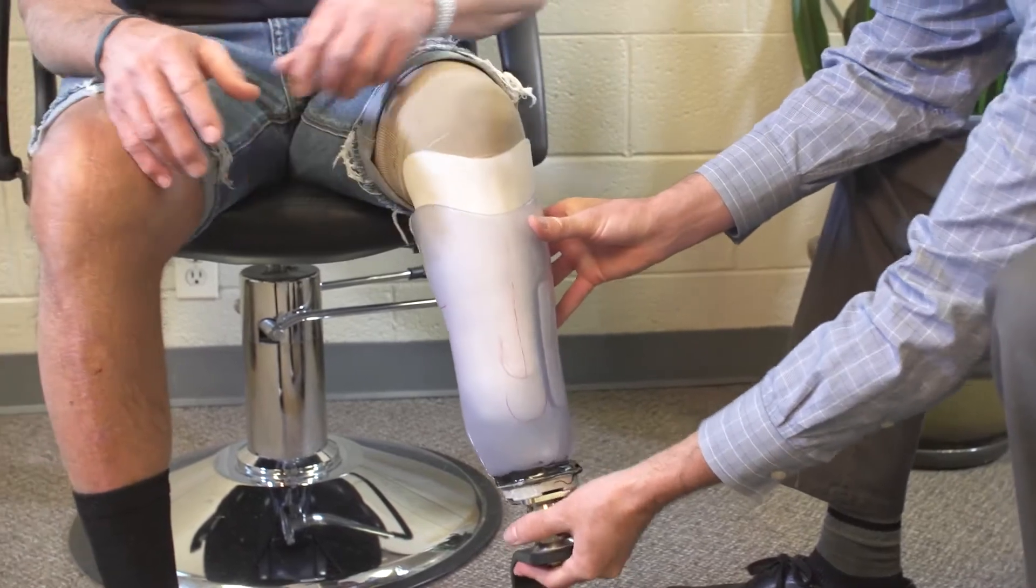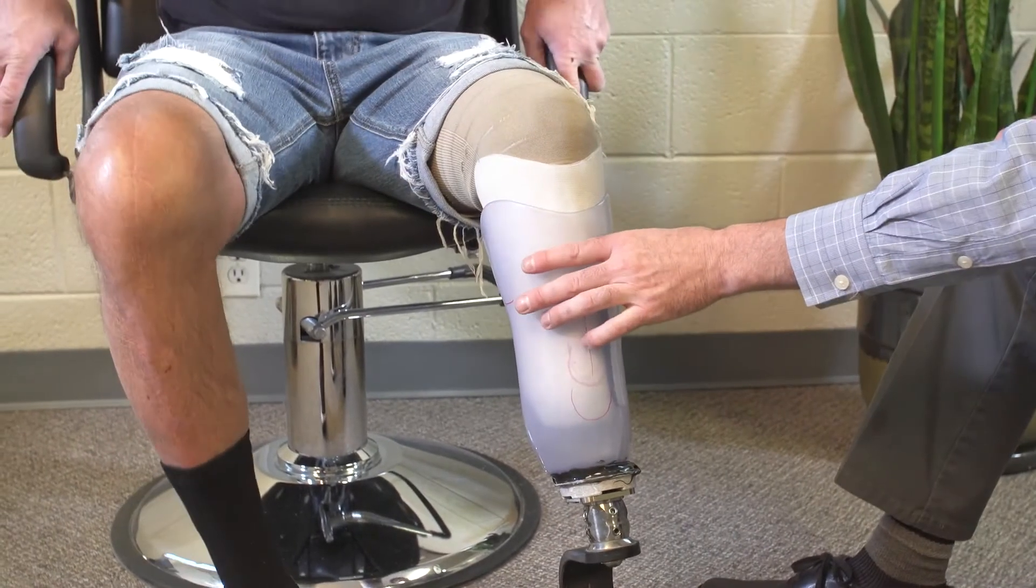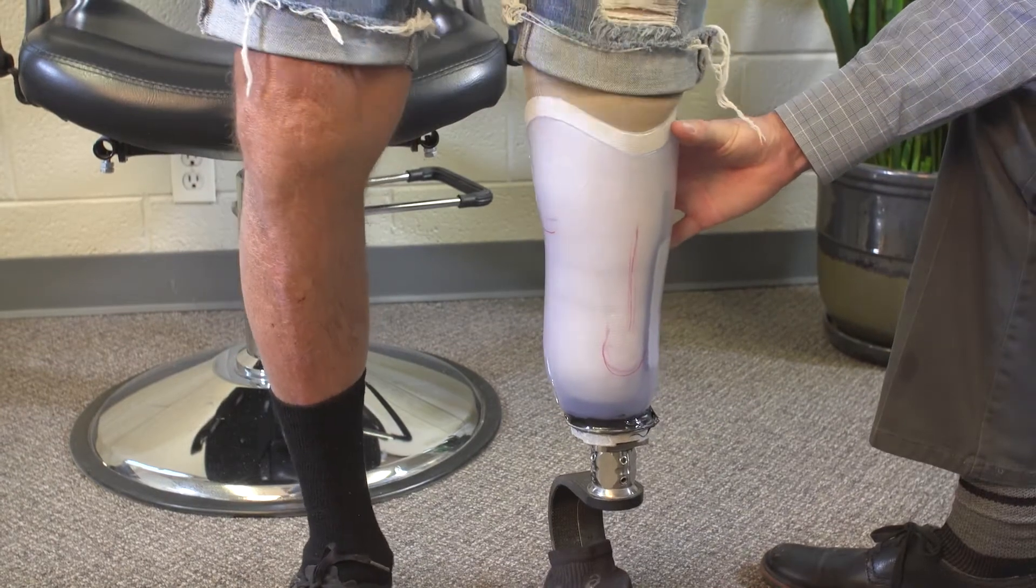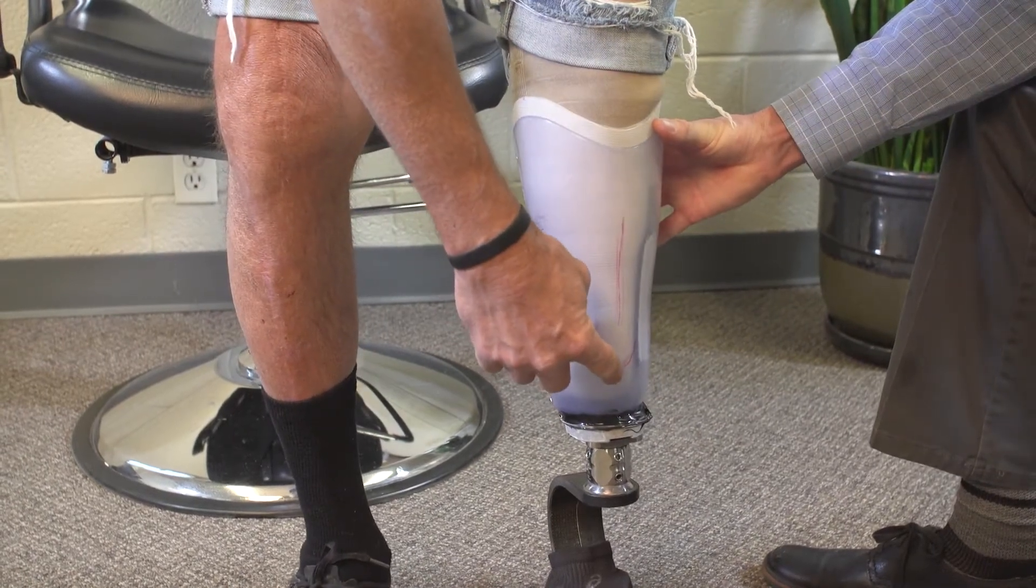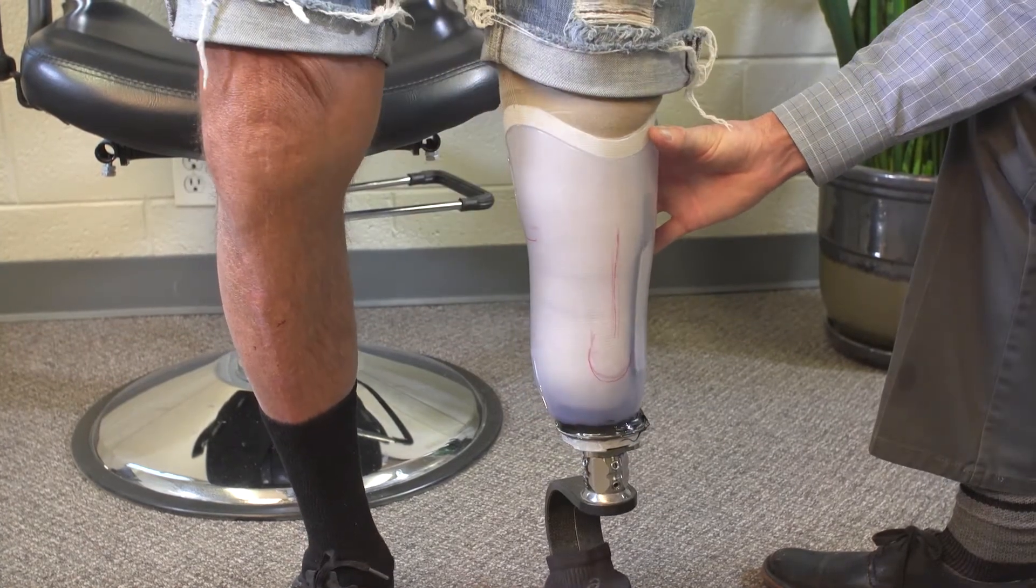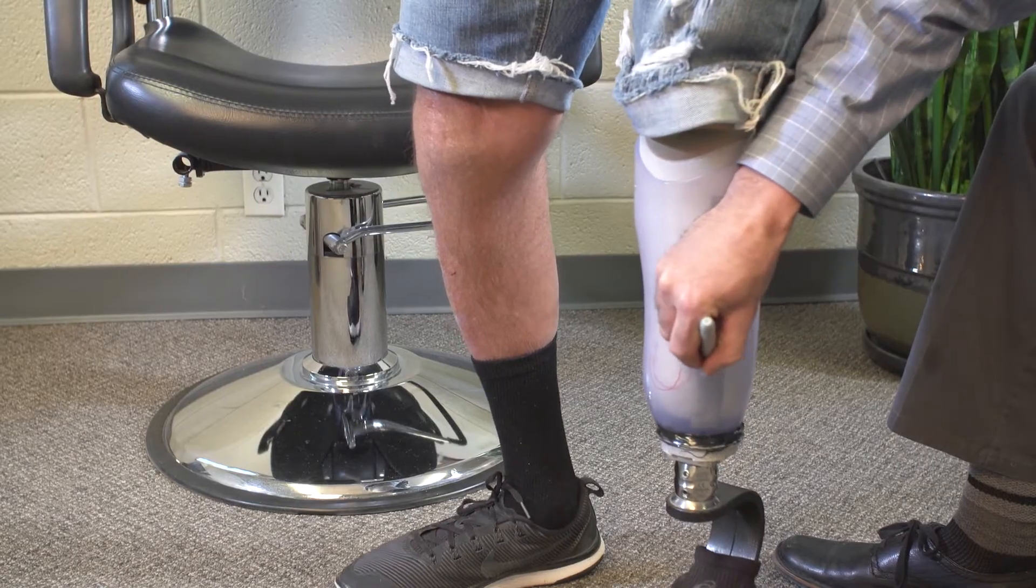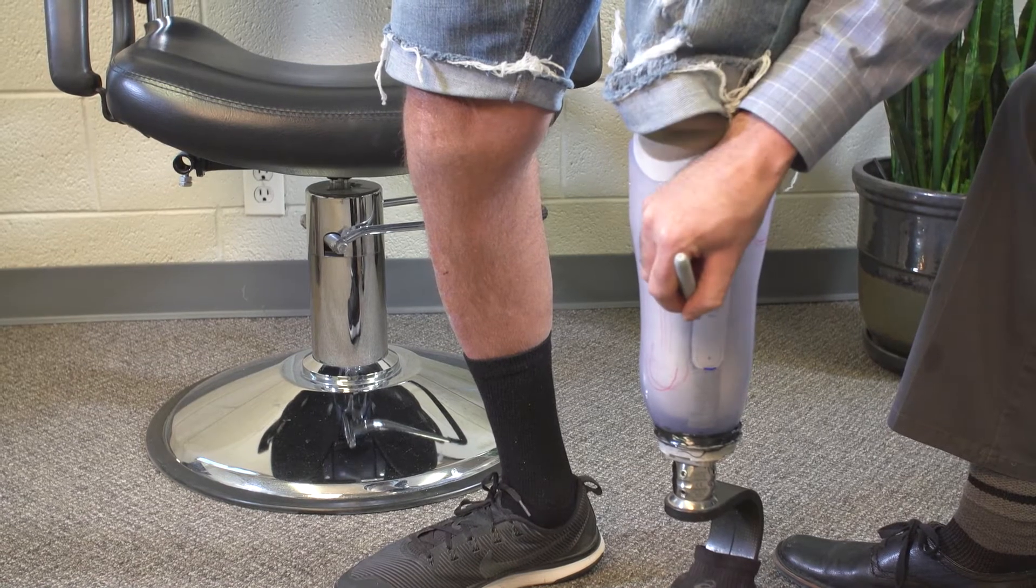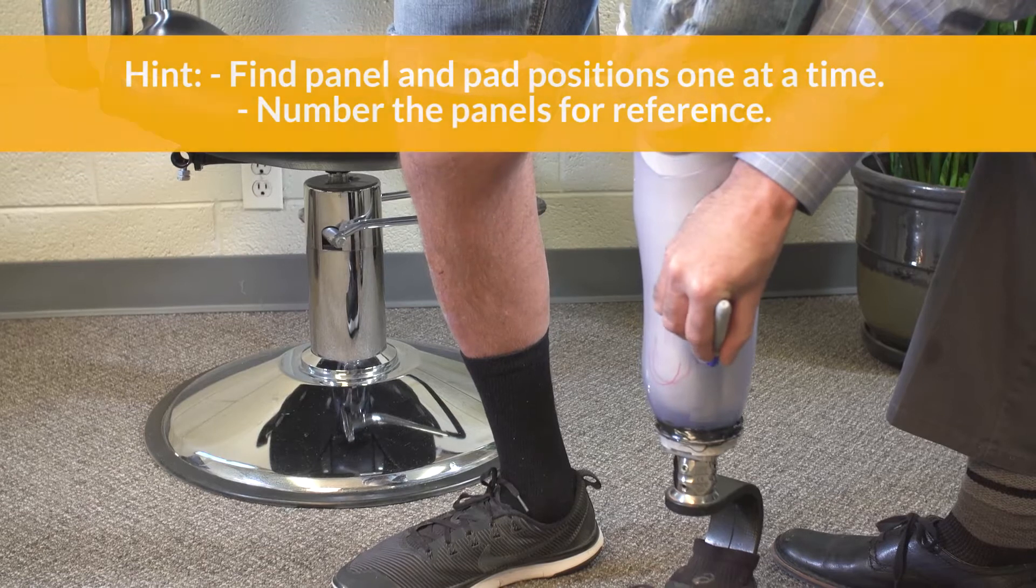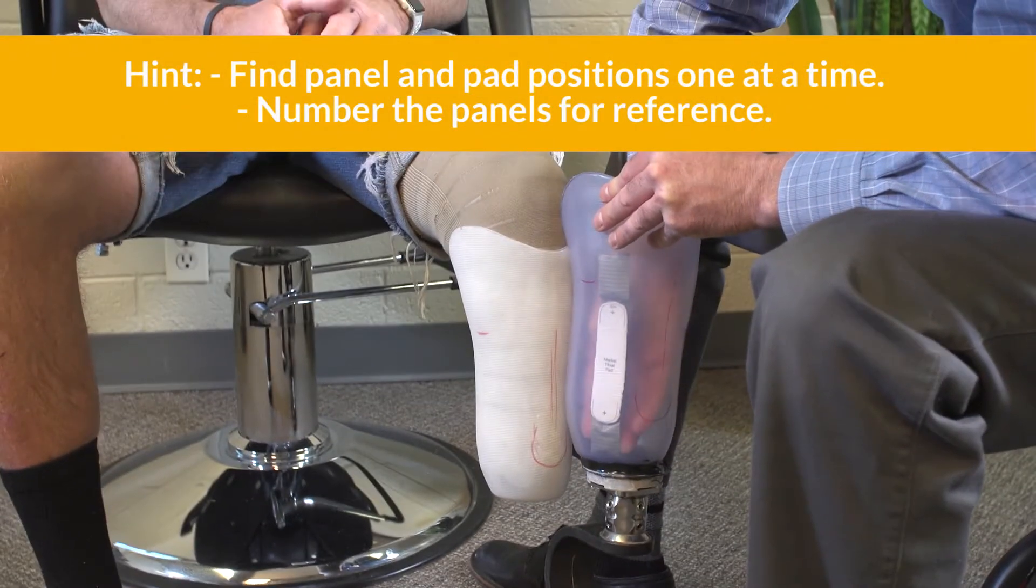Once a pad is positioned, have the patient weight bear in the socket. Work with them to refine the location, remembering that the pressure this pad creates will ultimately be adjustable. Once the patient is happy with the pad position, trace the location on the exterior of the socket with a sharpie. Repeat this process to locate the other two pads.